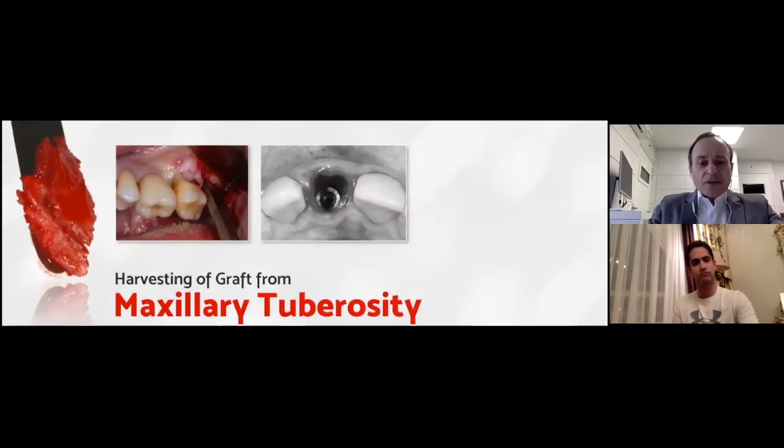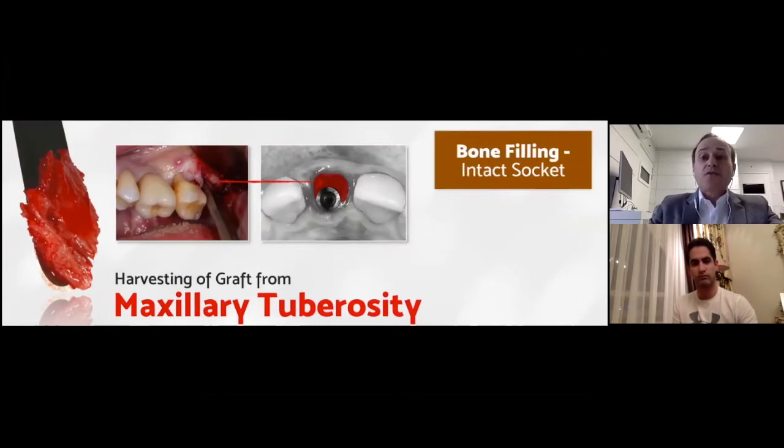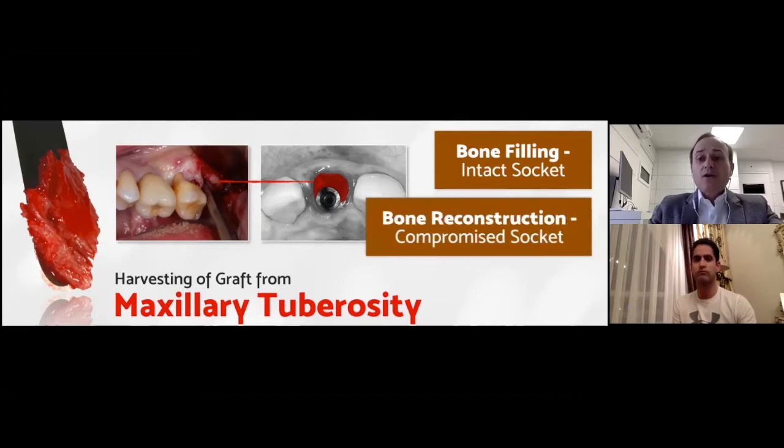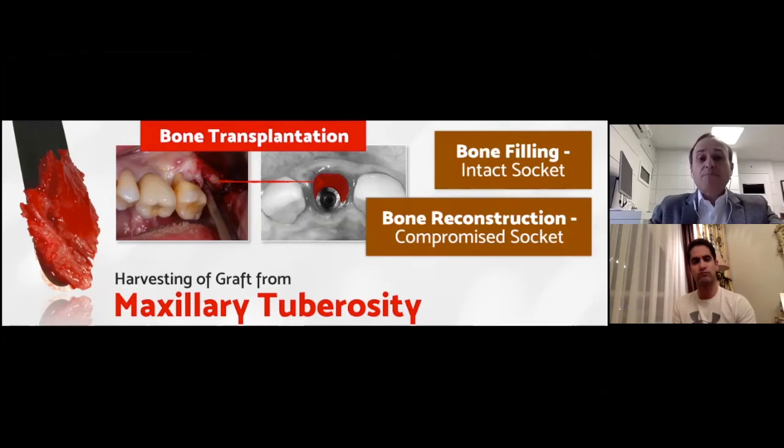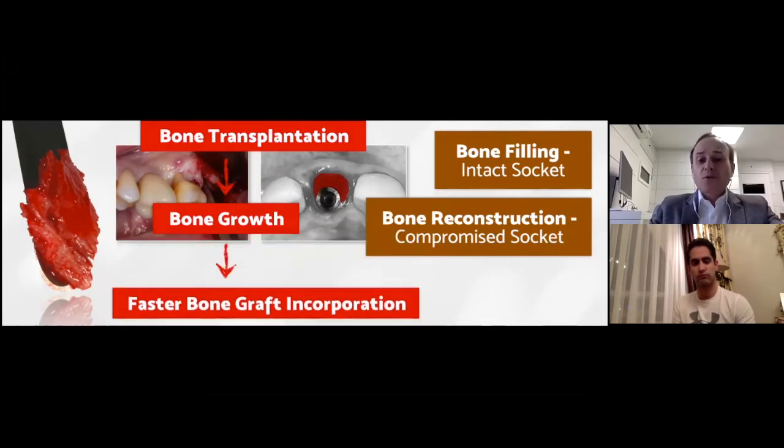Here you can see the CBCT scan after 10 years — make a comparison of how everything started. I want to call your attention not only to the thickness and height of the bone reconstructed, but also to the amount of bone that was remodeled over the implant platform. This is quite common when we apply this technique and follow this protocol. Let's talk about the donor graft area for the execution of the IDR technique — we are simply moving bone from the tuberosity to the receptor site. We use this piece of bone as a bone transplantation: a lot of viable cells, growth factors ready to be transplanted. We expect faster bone graft incorporation — in three months we can finish the case.